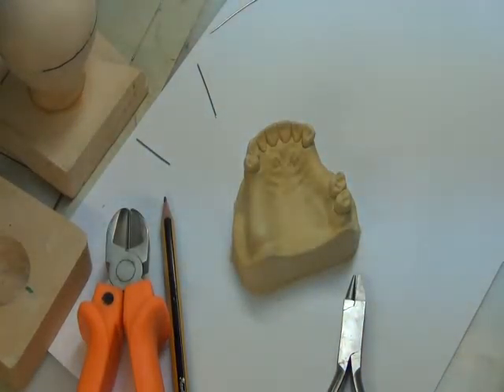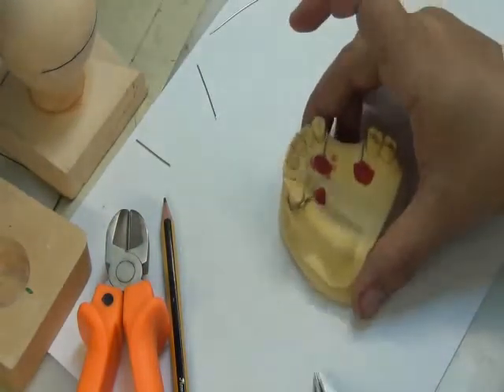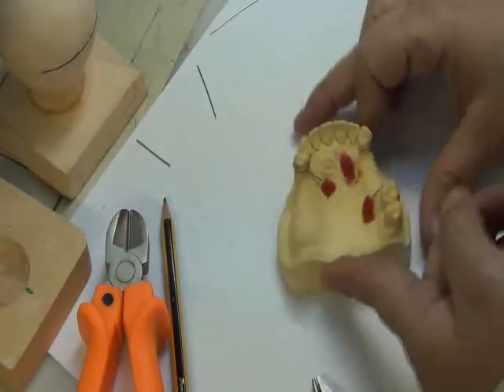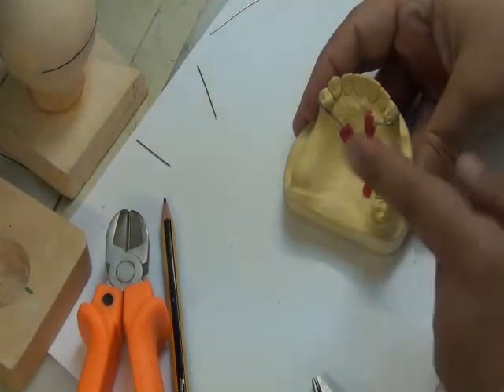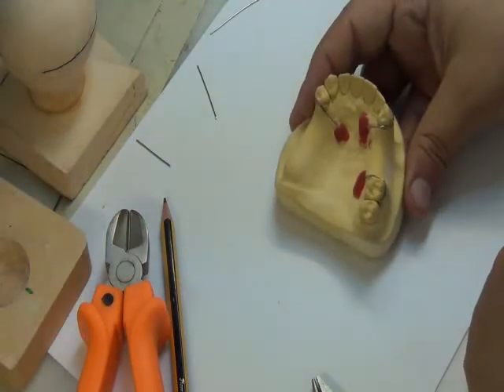Now in this part of the demo, we're going to talk about how to set teeth. Okay? So after checking the quality of our work, we will find that we have 3 clasps attached to our cast and ready to do the work. They have all of the features there. Okay? So we are going to select teeth to set this partial denture later on.